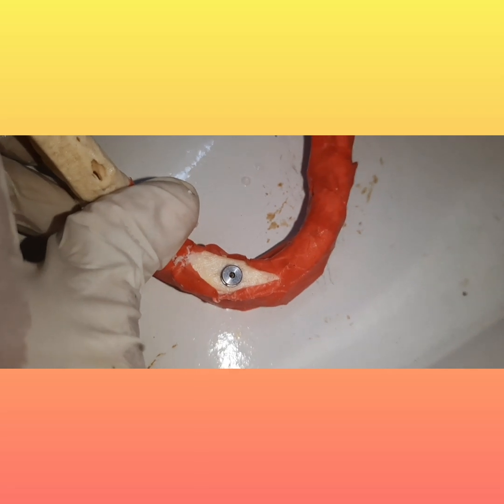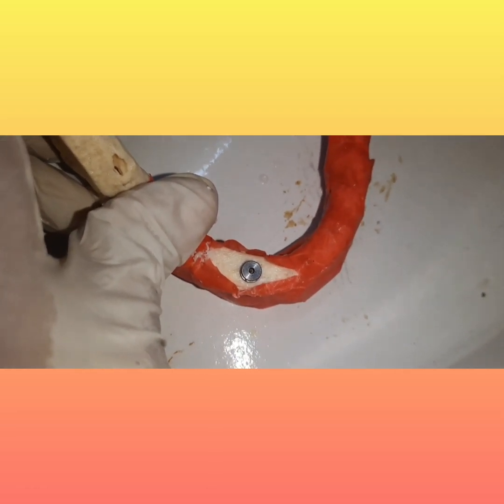Next, use sharp disposable drills. You use a light and intermittent drilling pressure. As I told you, never apply pressure onto the bone. You always use that in, out, in, like this. And the rotational drill speed should be controlled.